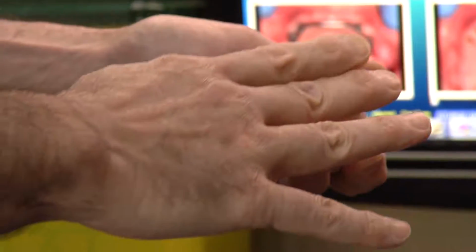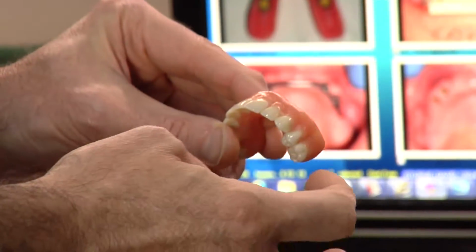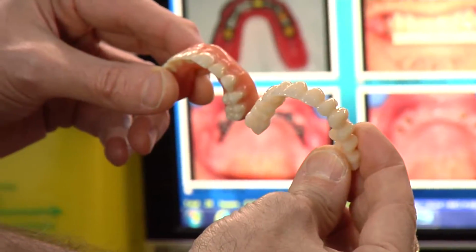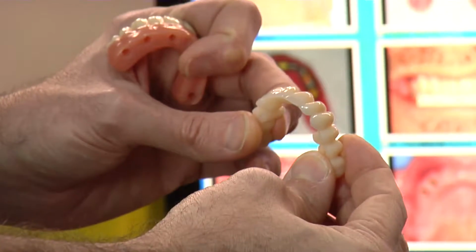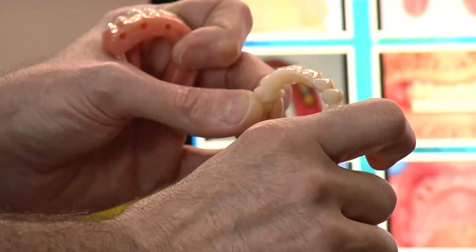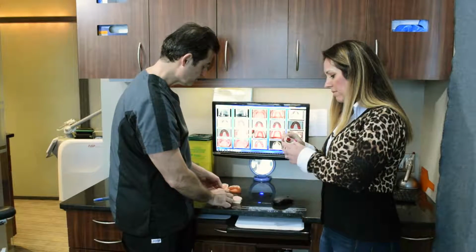And this is made totally differently than this. I described to you earlier how a denture's made. It's individual plastic teeth held together by this pink resin base. With a bridge, there is no resin base. This porcelain bridge is actually milled out of a solid block of porcelain and the teeth are all joined together. So this is not individual plastic teeth that are somehow glued together. This is a one-piece porcelain bridge. Wow. And then that can be screwed into place.